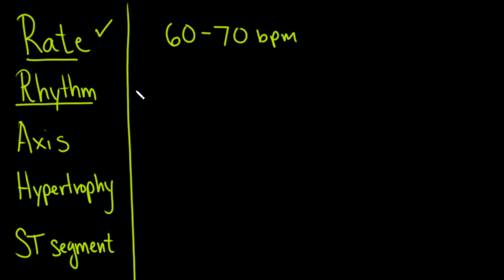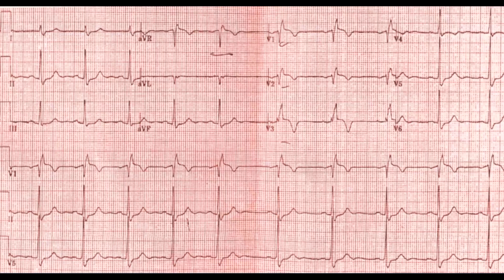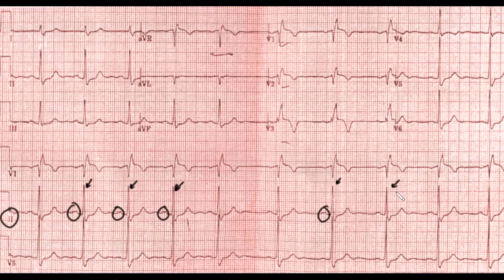Next, let's go on to rhythm. The best lead to look for rhythm is lead II, which is the rhythm strip. We're going to look for each QRS complex and see if there are P waves before each one. We can clearly see P waves before each QRS complex. There is this little extra beat here — that's probably a U wave, sometimes associated with low potassium. But clearly, we see P waves before each QRS complex, so we're going to call this sinus rhythm.